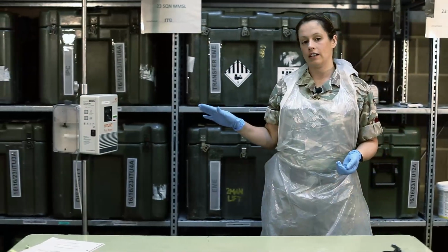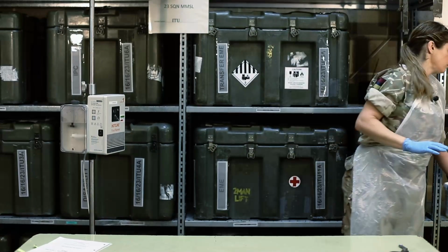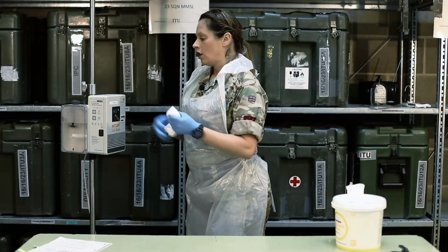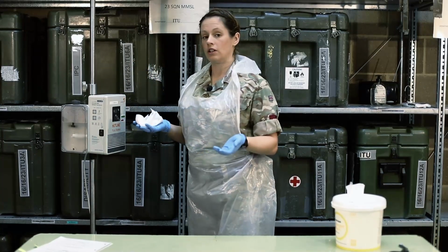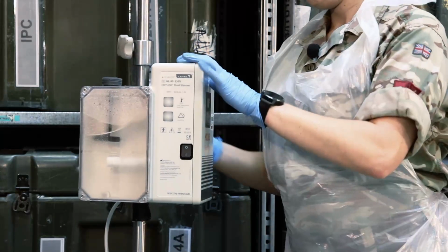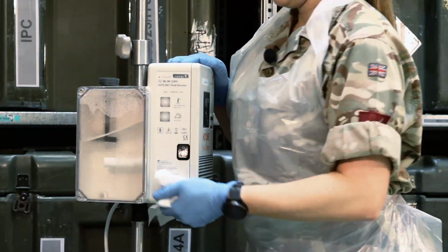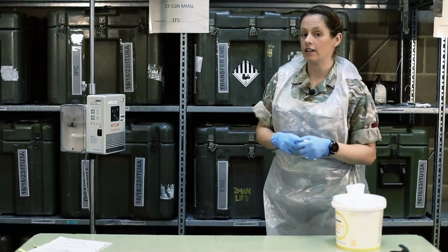To clean the Hotline fluid warmer, you just use a soft detergent. So the green or yellow Clinell wipes are absolutely fine, and these are readily available within Defence. You can keep the water in there, that's absolutely fine for 30 days, so I'm not going to discard that right now. Give it a wipe. And then it's ready to use again.